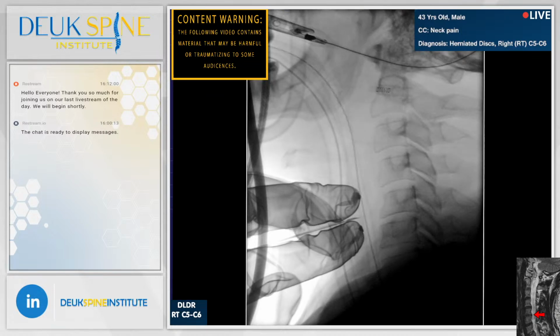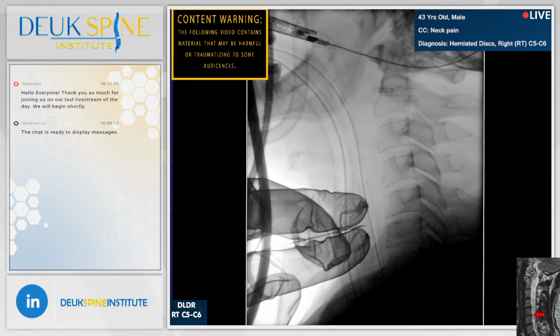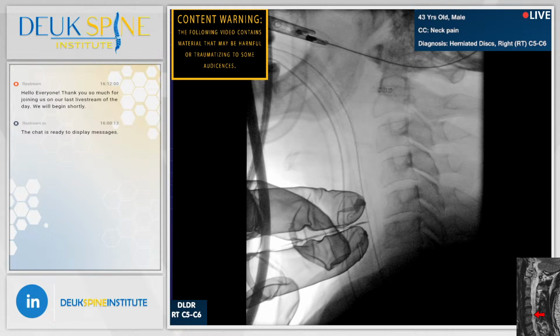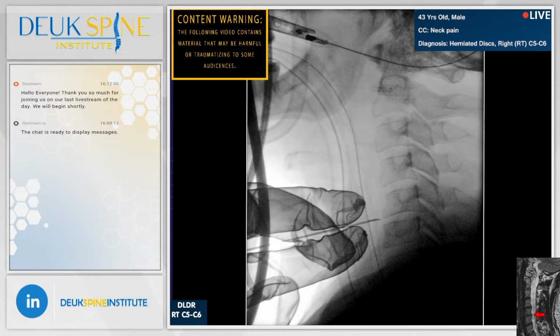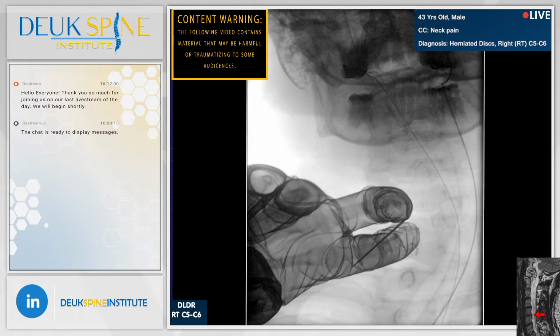Now we call this the Deuk laser disc repair because we do it a special way. We use a laser to clean out the back of the disc. Quick AP, I need to make sure I'm in the middle. Oh, it's perfect. Let's go back to a lateral view. Quick shot.